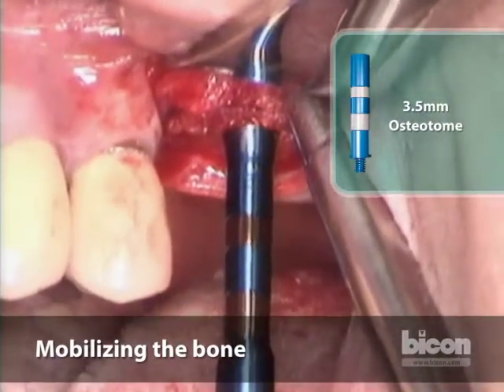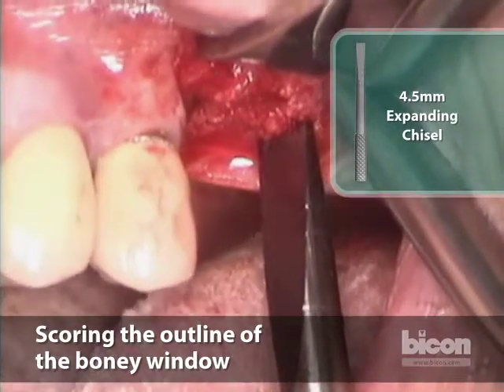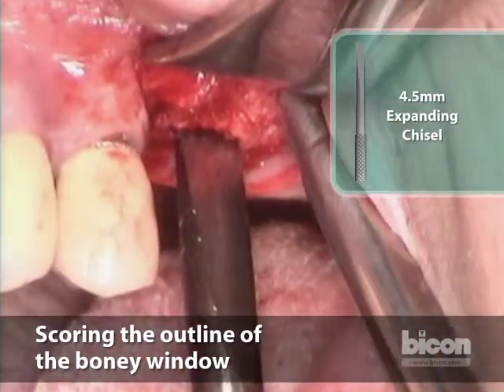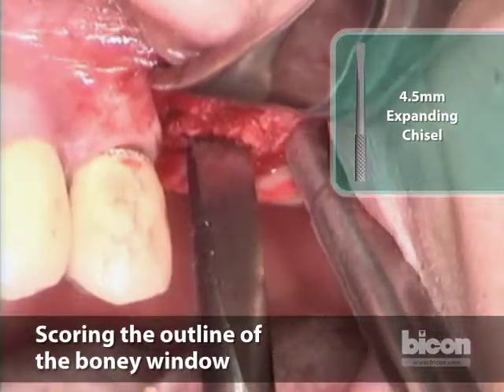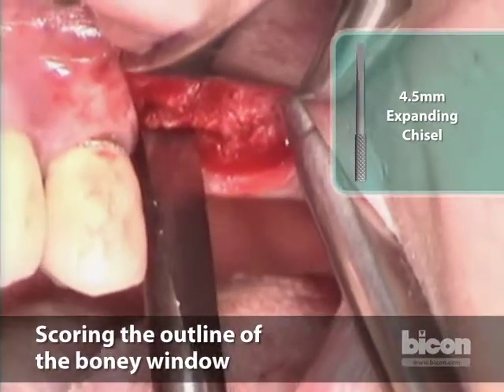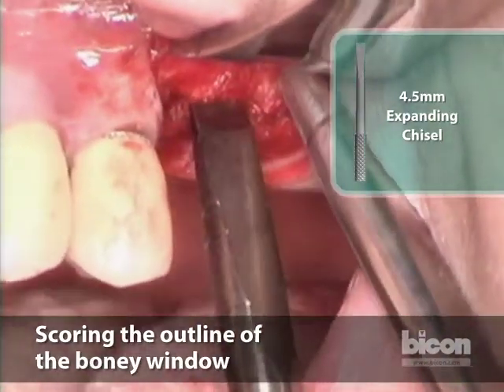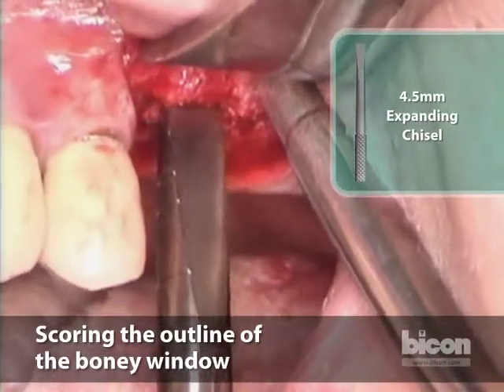So far we have not mobilized it as well as I'd like to see it moving. This part I'm almost positive we have scored deeply enough; this part is the questionable part. I'm going to go back over the facial again — and for those of you who've watched these webcasts before, you know that sometimes it takes quite a bit of doing to get to the final mobilization.